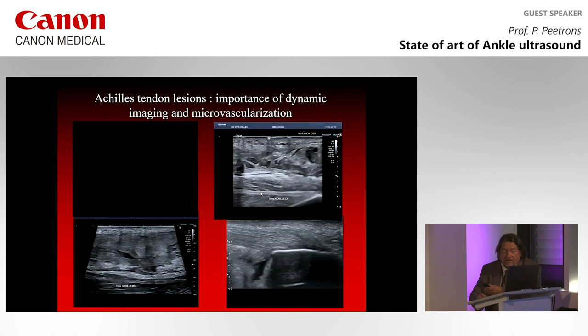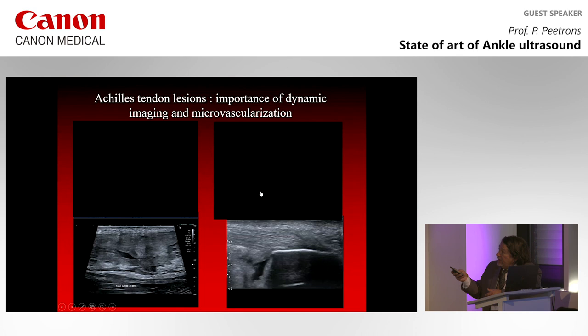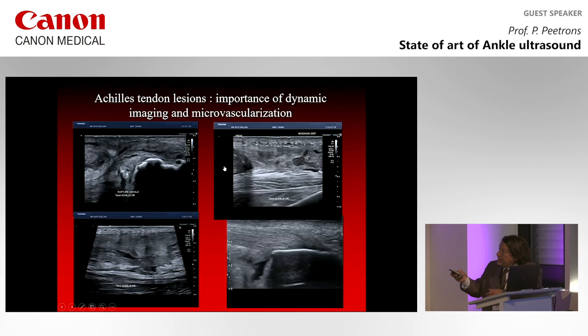In this other example, you can see that this is moving with the foot and this is not moving with the foot. So you can exactly measure where the two stumps of the tendon are. One part is there, and the other part is there. And you can measure and tell the surgeon that he has maybe 2 centimeters between the two parts of the tendon.